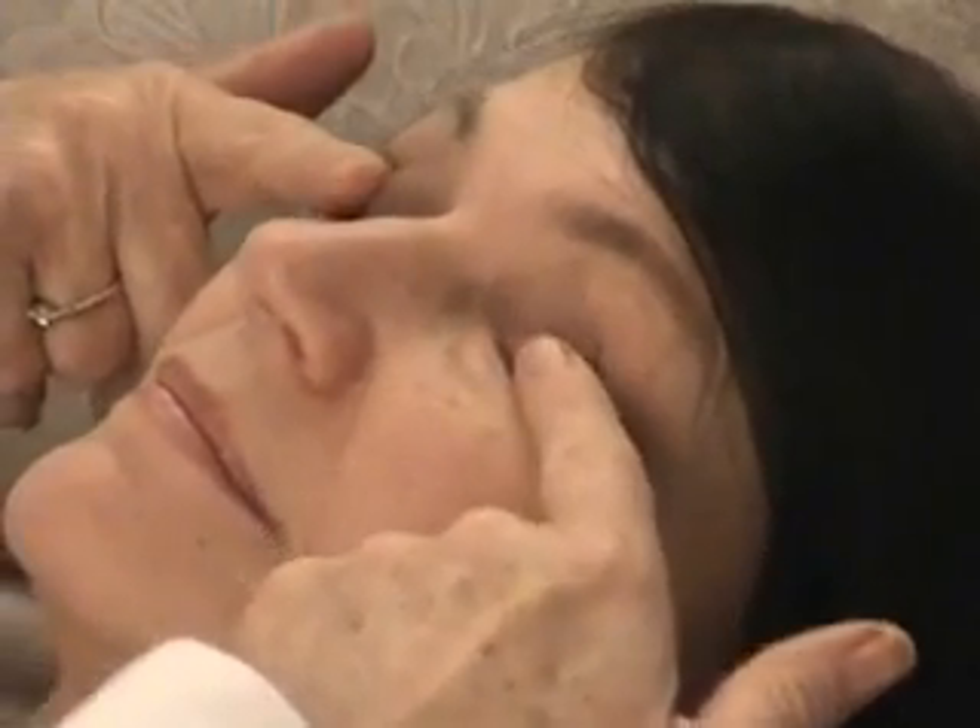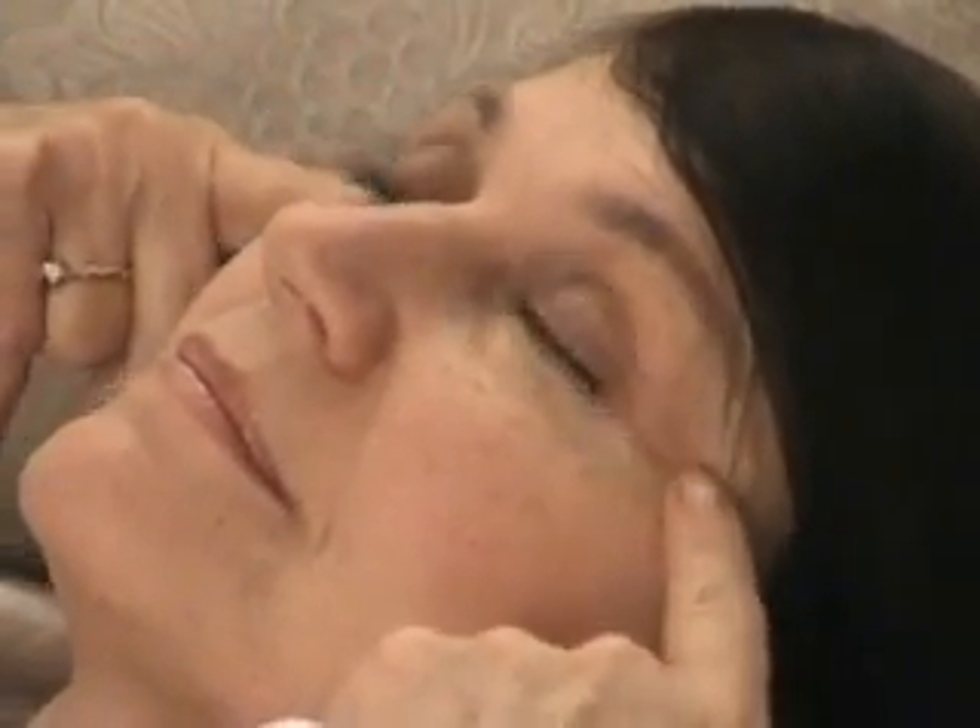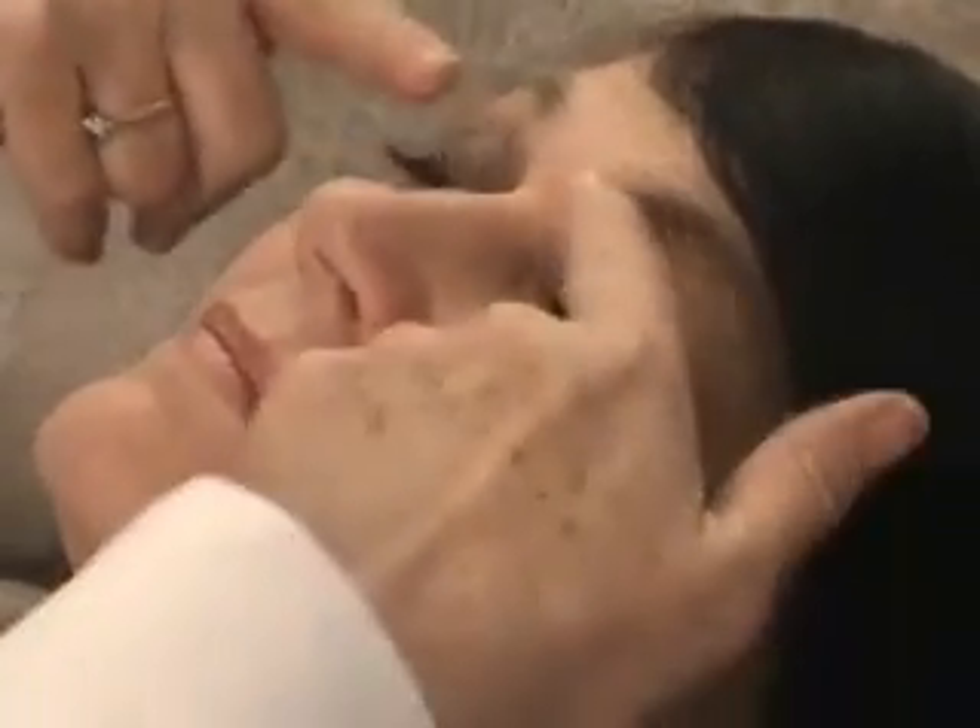Immediately after you remove the eye bag, massage your eyelids firmly like this, using outward massage actions. This may cause temporary blurring, but you will feel some relief from your symptoms immediately.